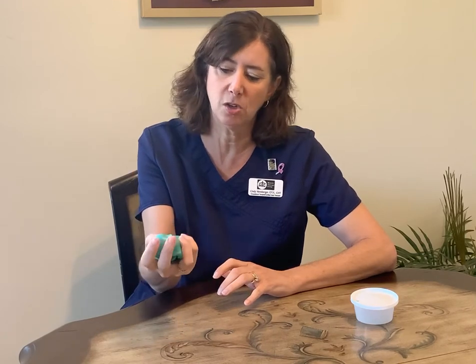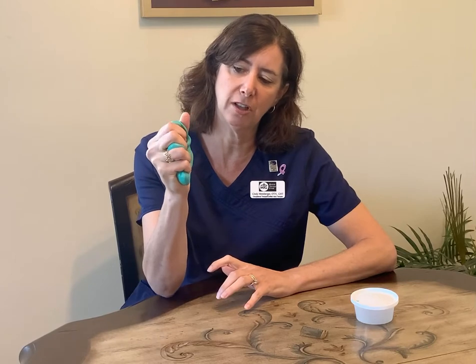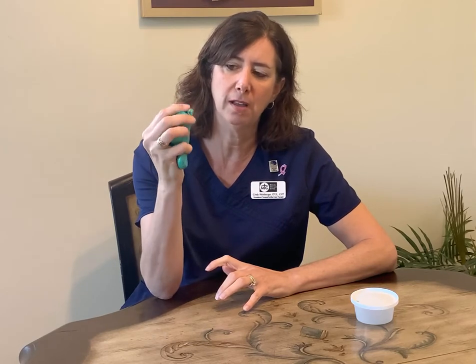First one is just full grip. You want to try to squeeze the putty fully, get your fingers to kind of curl and dig right in, and then use the same hand to manipulate it into a new ball in order to squeeze again. That's the first one. Second one I like is for tip pinches.